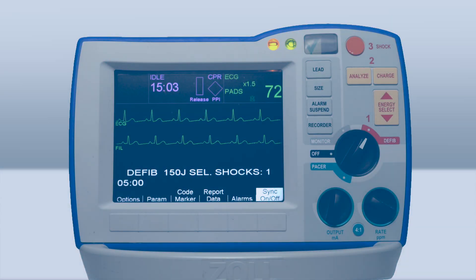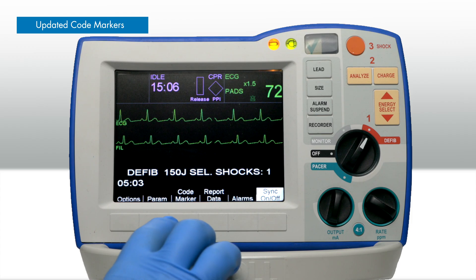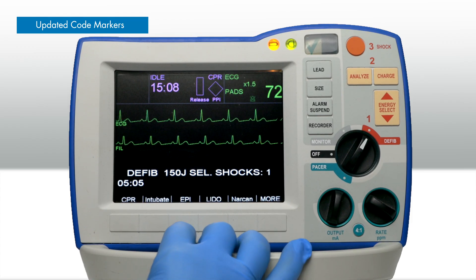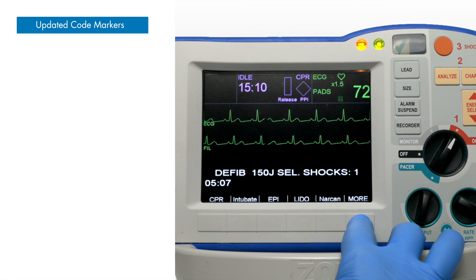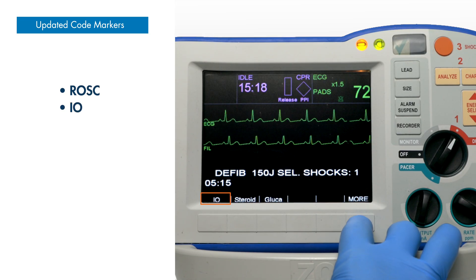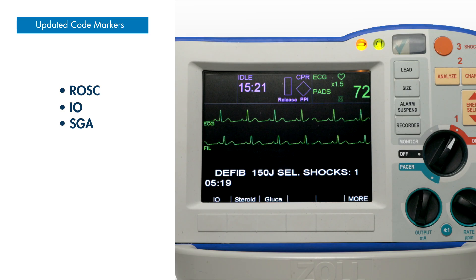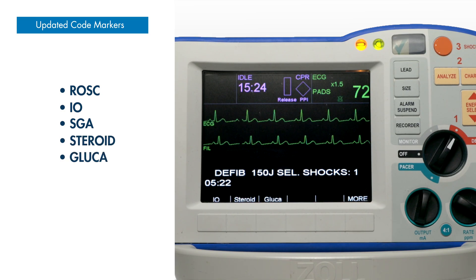New configurable code markers were added to include a broader range of procedures and notes. The expanded list includes ROSC, intraosseous IO administration, supraglottic airway SGA, and steroid and glucagon administration.